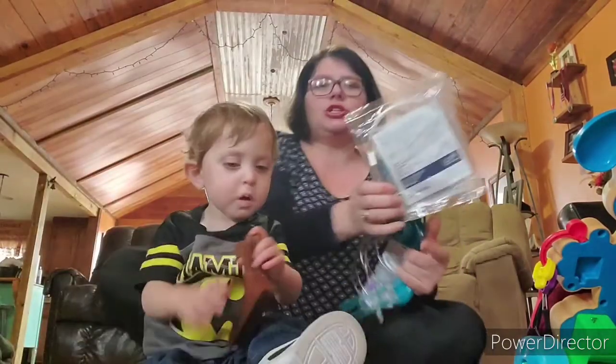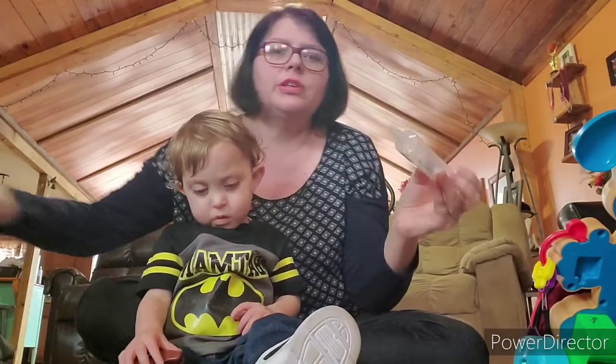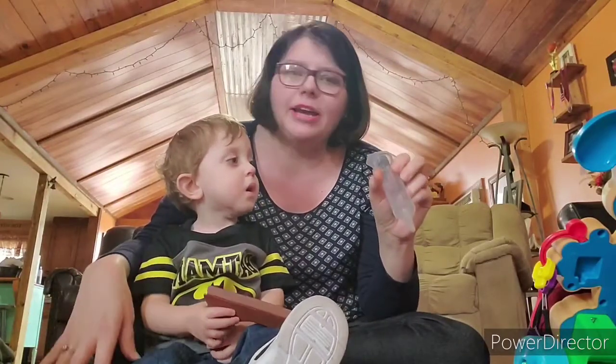I always keep an extra couple of extensions with me as well. And then of course a couple of extra syringes, just in case the bag breaks, or maybe for water or juice or whatever. So I always just keep a couple extra.